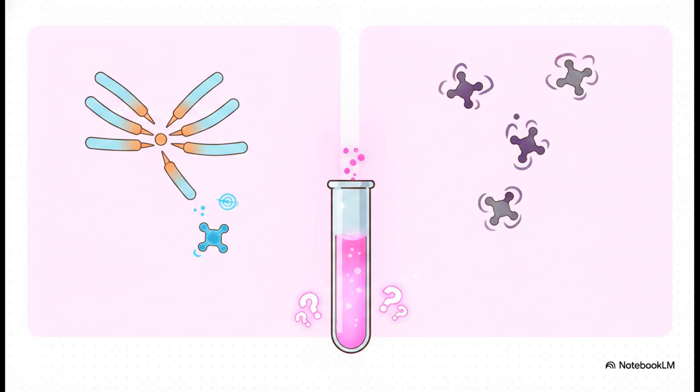It's kind of like trying to count only the people who took off their hats inside a room, but your machine is accidentally counting all the people who walked in already holding hats. The machine just reads that final color change. It has literally zero idea where the glycerol originally came from.